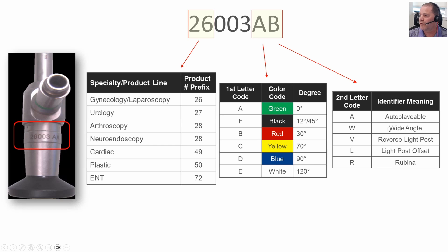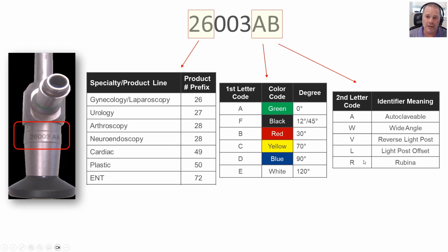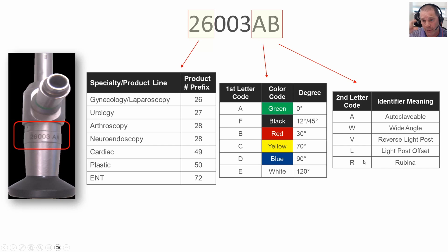In this example, the 'W' indicates a wide-angle telescope — a wider field of view. Or maybe it's something with the light post being offset, which is useful in sinus procedures where you want the light cable out of the patient's or clinician's field of view. So those are some of the different things manufacturers use to identify telescopes. The model number is always a good indicator, and the angle of view with a numerical value on it is commonly used, though it's not fully standardized across all vendors.